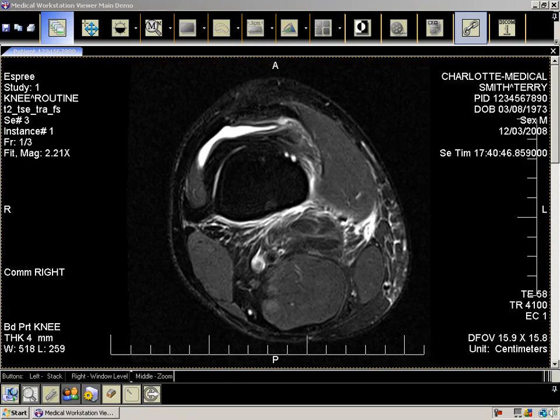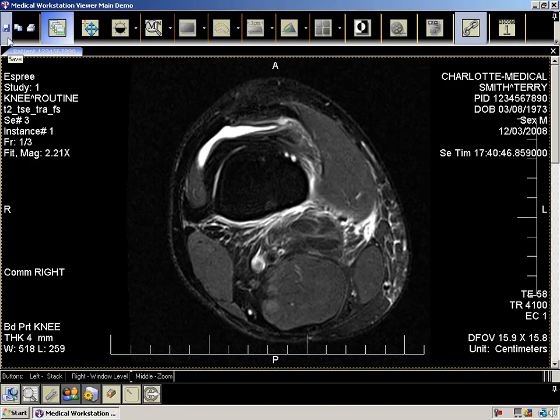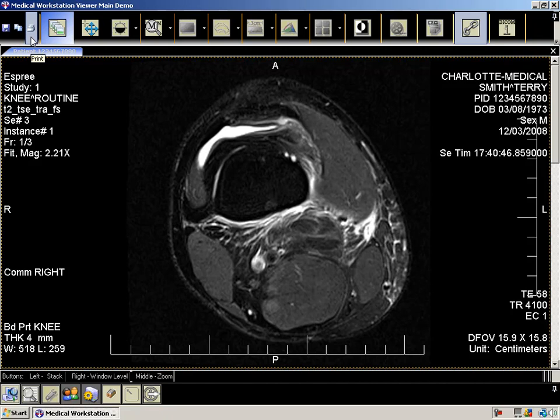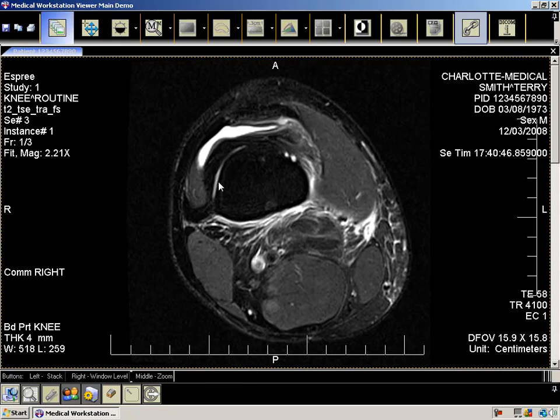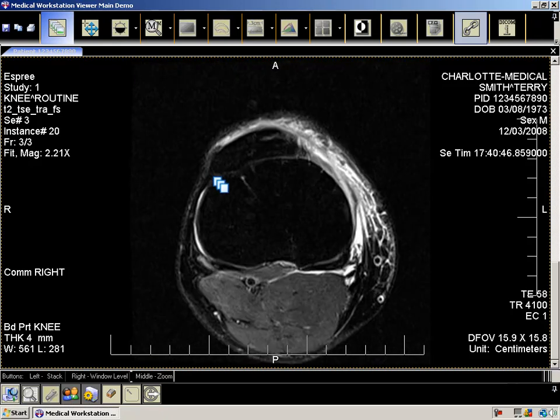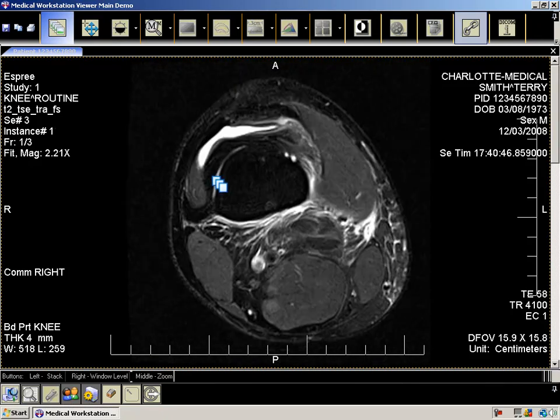Now let's go over the toolbar. In the upper left-hand corner, you have the ability to save the image to a BMP or JPEG file. You can copy the image and paste it in another imaging application, or send the image to a printer. The next feature, selected by default, is the stack. This allows you to scroll through the different frames of the image. With the left mouse button pressed, move the mouse up and down to scroll back and forth through the frames.